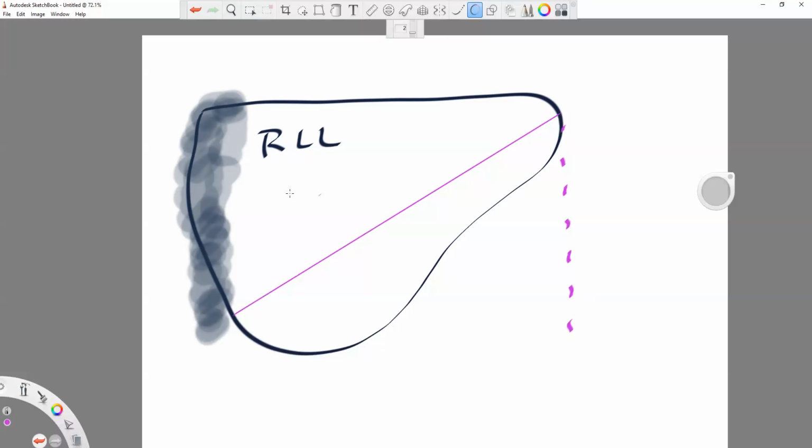and then an actual line. What we're supposed to be measuring is the greatest length, superior to inferior, cranial caudal, the cranial caudal length. Whereas this is the longest distance possible. I forgot what, the greatest diameter or whatever. Now it's not going to be a huge difference, but when we're talking about the difference between hepatomegaly or not, this does count for something.